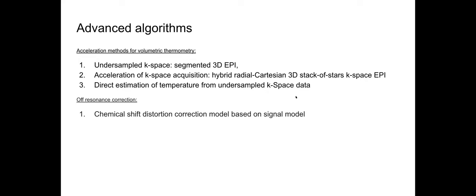Because MR thermometry is prevalent in MR-guided HIFU applications, which require real-time monitoring of local temperature change, we decided to perform experiments that generate local heating. I'll hand it over to Yuhan to talk about the details of the next set of experiments.